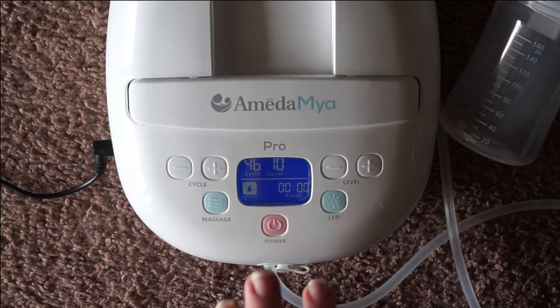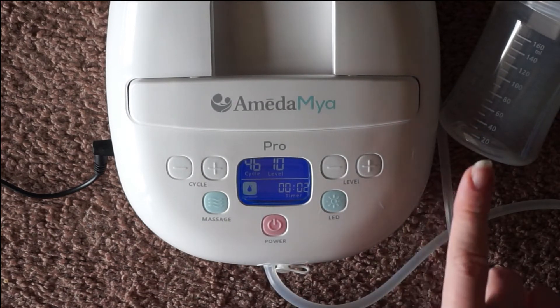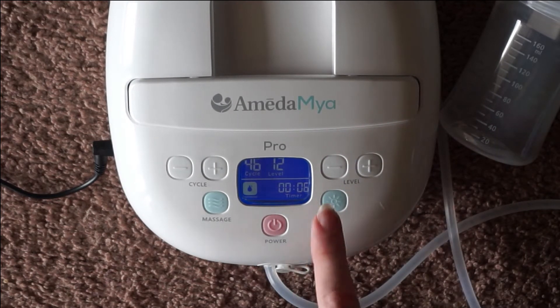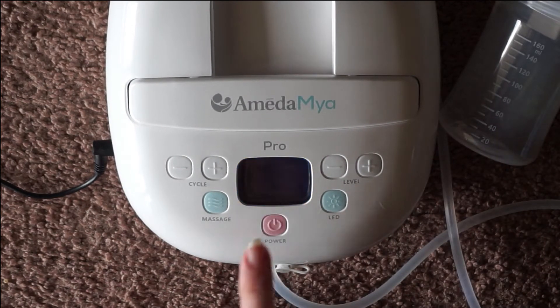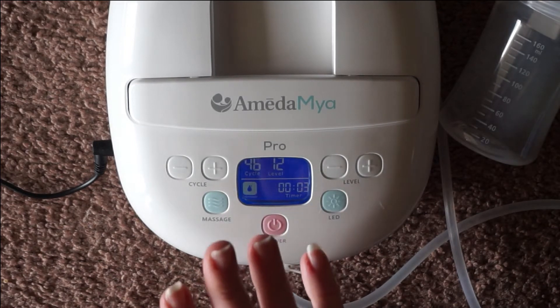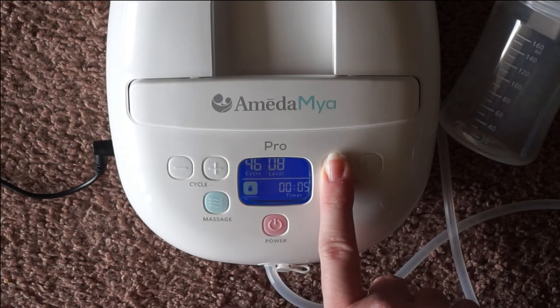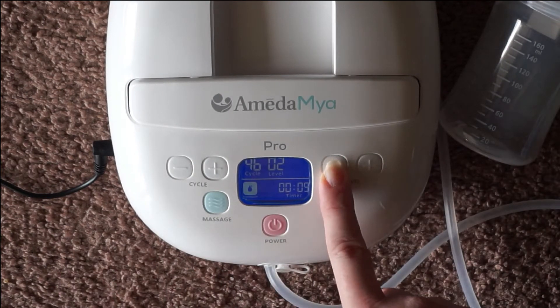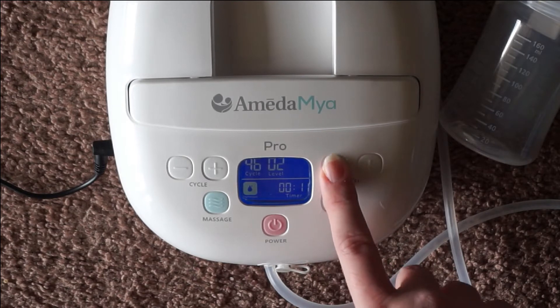If we go ahead and turn this on, I have it started up at a different level — I just want to show you this. It is going to start off wherever you left it at. You can see I increased it, turned it off, turned it back on, and it's exactly where we left it. For that reason, you're going to want to remember to either decrease your settings before you're done or turn it down once you start up again.